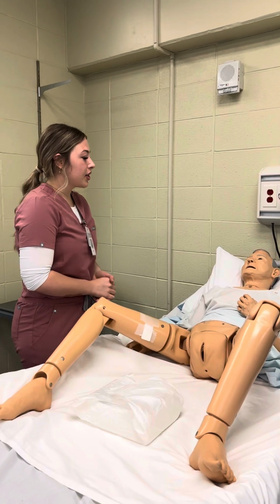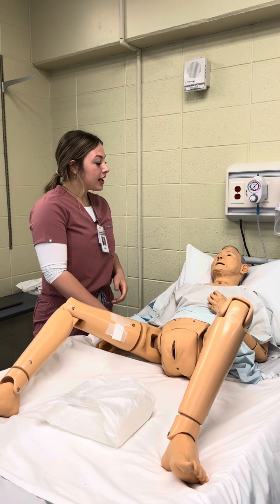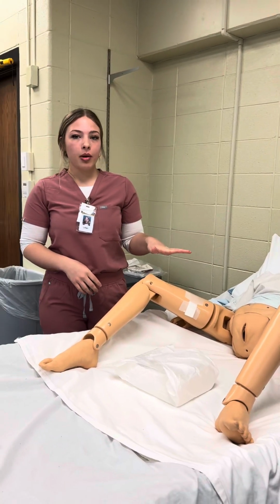Hi, my name is Lily. I'll be your nurse today. I'll be putting in your catheter. Can you tell me your name and date of birth? Okay, and that checks out. Do you have any allergies? No? Okay, so the patient is already in the proper position.